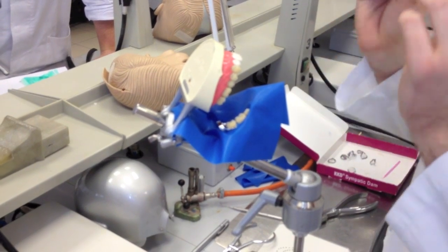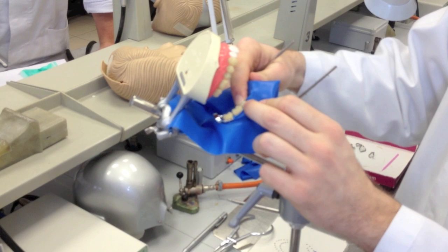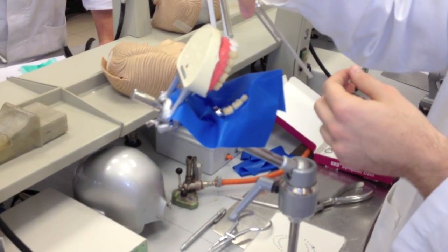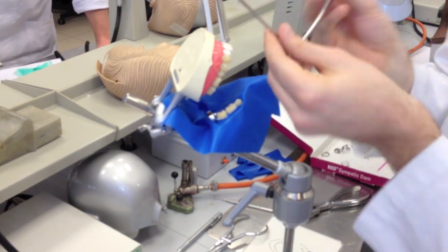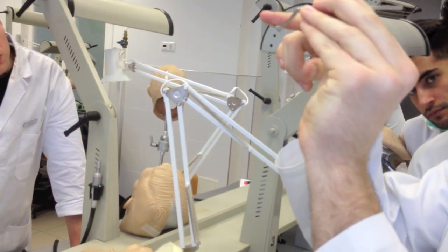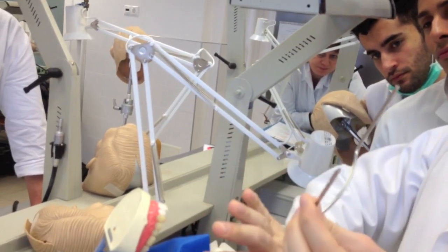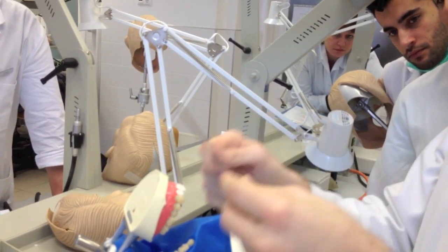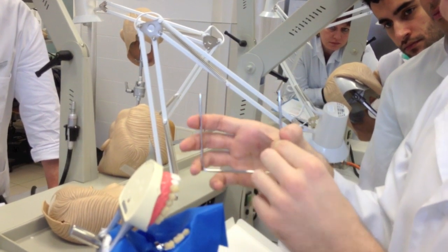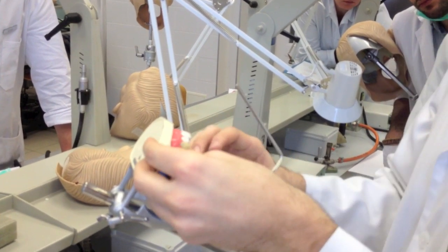After this, you should apply the frame. So we have the clamp on, all the teeth are involved — you should place the frame. Not like this and not like this. You will see it has a curvature. Not all of the frames are like this, but this one has a curvature here and the face has a curvature too. Try to fit them, because in the wrong shape it's not really comfortable. You should do it together with the assistant.